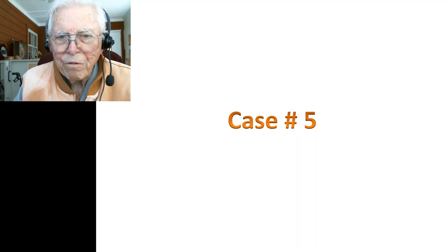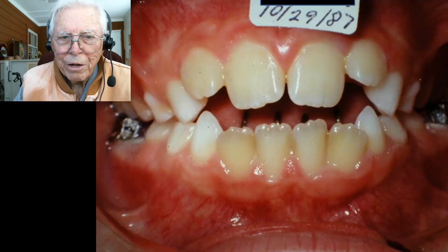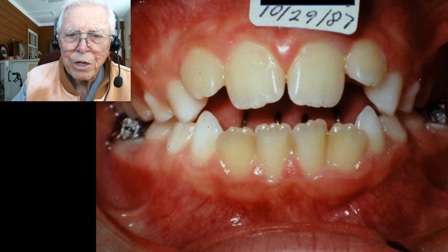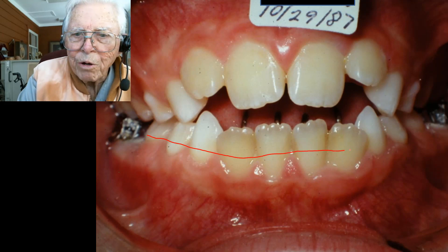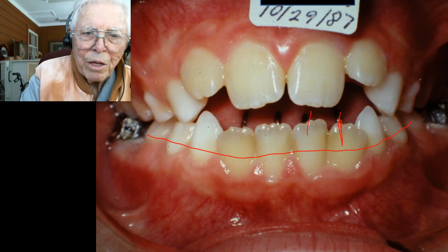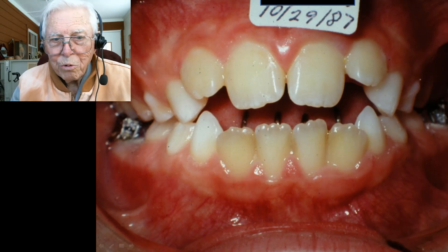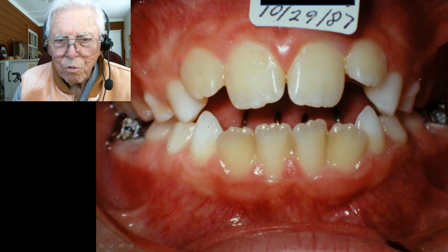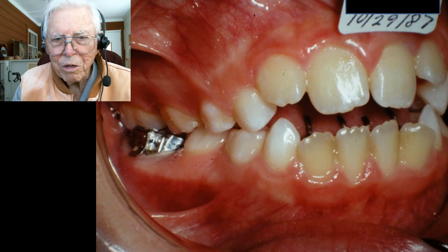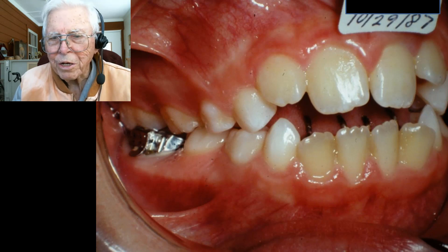Case number five is a young man who's got a pretty good open bite situation going on. This time we bonded a lingual arch, and took the lingual arch and bonded these little wires to that — the heavy wire going along in here, going back to the six-year molars. We bonded the hook wires to that. It doesn't seem to matter much what we use, just so we put these fingers back pointing toward the tongue. The tongue would come up and hit these points, and then just once or twice, and then it didn't come up there anymore.